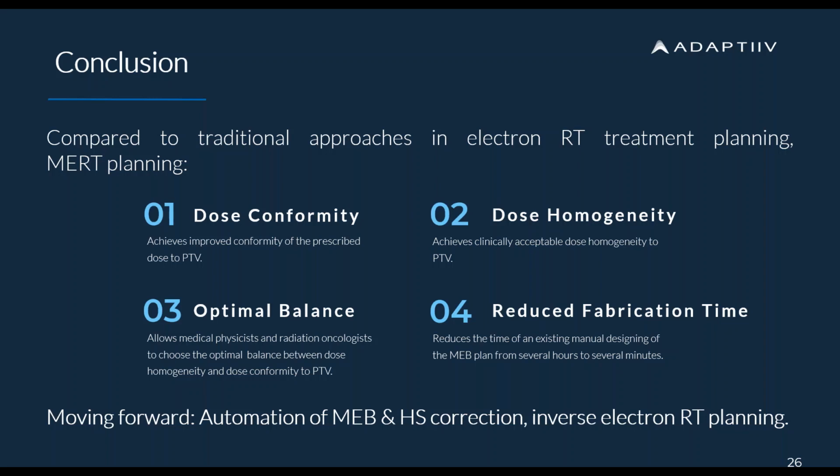I mean, it's not secret, but it's the part of the algorithm that we searched for some time, because we tried several things before that, but the best results would come if we only reduce the peaks and don't touch the valleys. So peak to valley ratio basically accounts for reducing just the peaks.